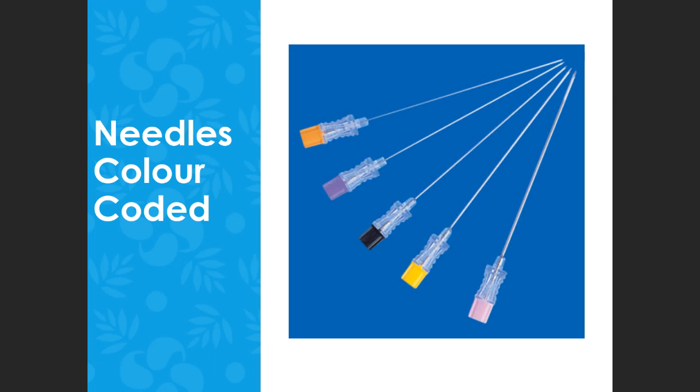Again, see the color coding? Everybody see that? Again, 25, 24, 22, 20, I think. This might be 18. All right. The bigger the number, the smaller the needle.